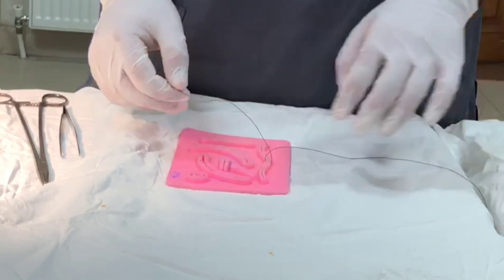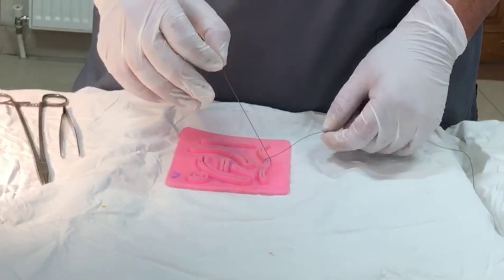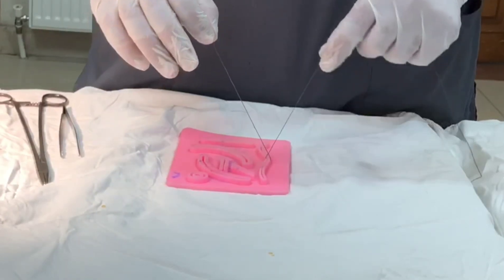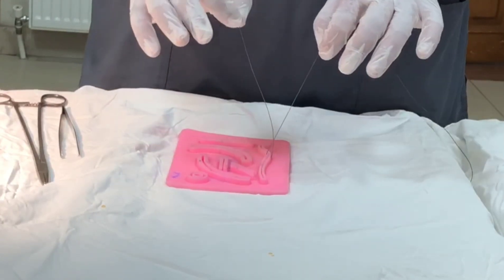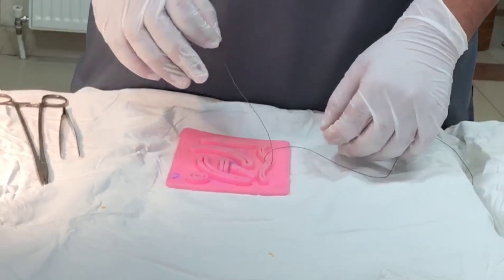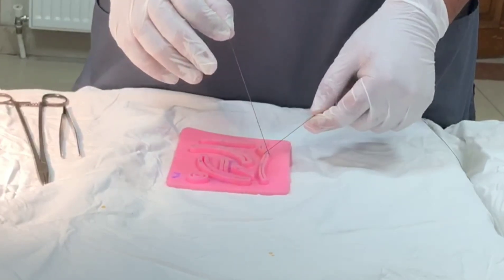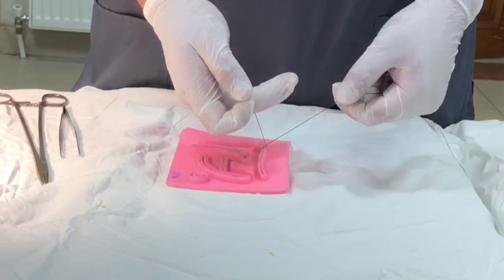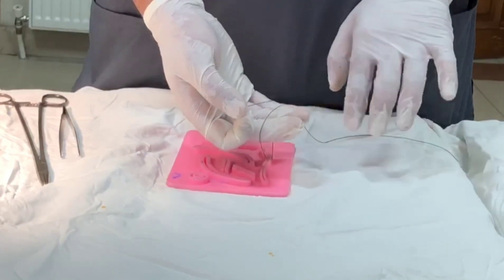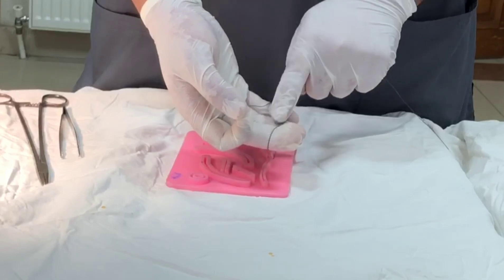Cross the suture before you tie a reef knot with the right hand. Watch carefully — the position of holding the suture is the key to learning knots in these videos. I'm just going to wrap around and come over. These two sutures should be parallel to each other — do not cross them.